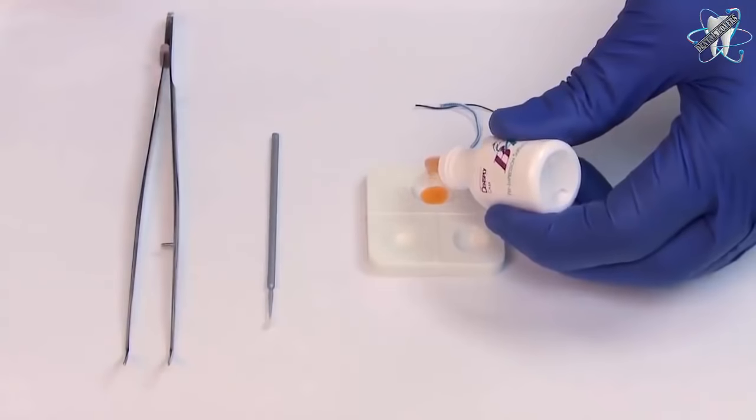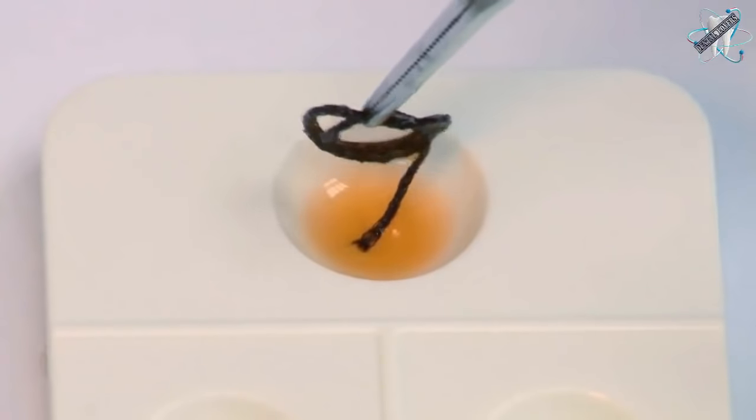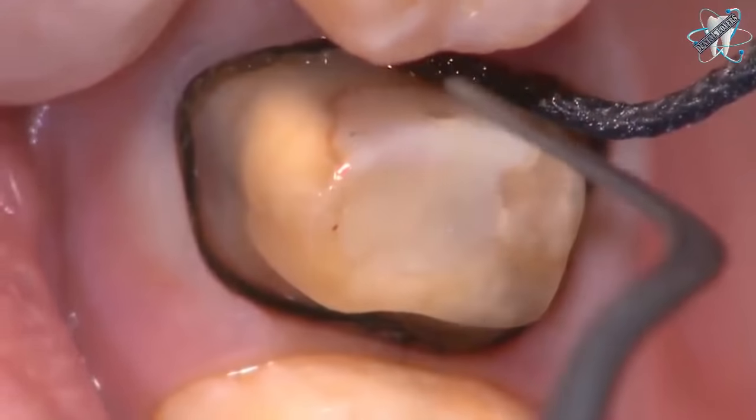For this subgingival preparation, the double cord technique will be used. First, a thin cord is soaked in B4 pre-impression surface optimizer and then placed. Then a larger cord is soaked in B4 and packed to achieve retraction.